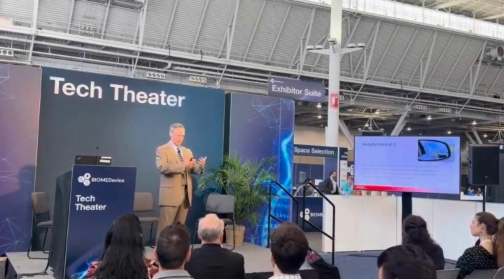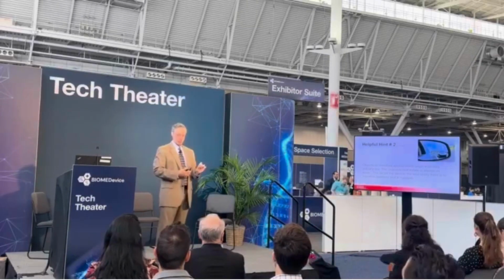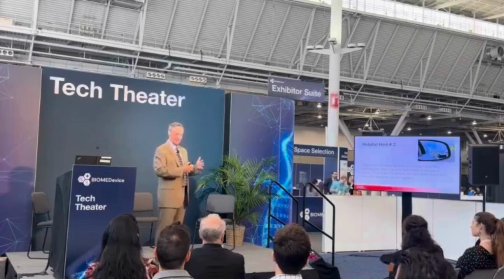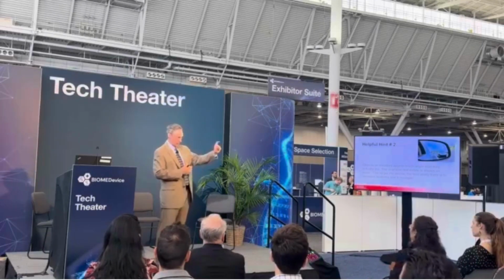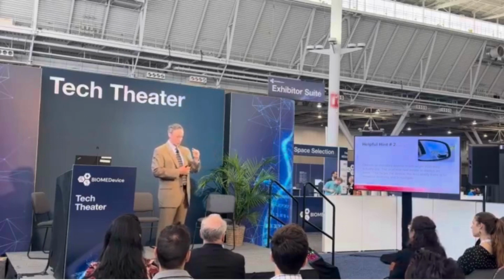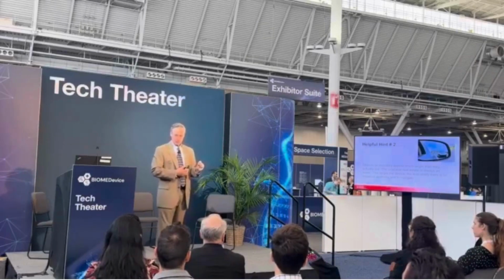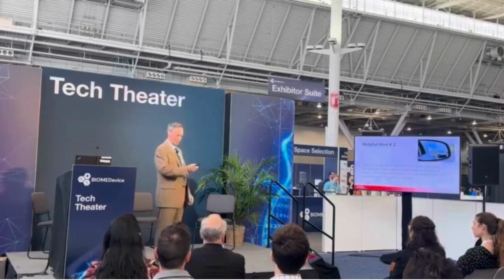It looks like the size of a Volkswagen on the screen. You don't have that much room, especially in very tight, constrained spaces. So be aware that although it may look large on the video screen, you don't have that much real estate, and real estate is always an issue when you do all that stuff. And it gets back to that leveling and positioning, all that. You don't want that.